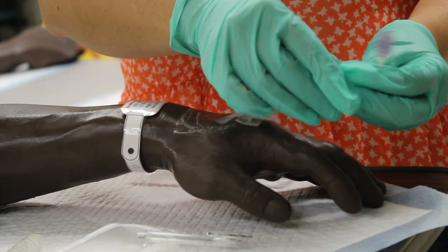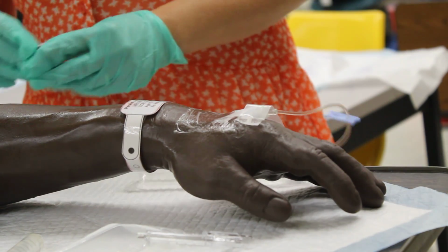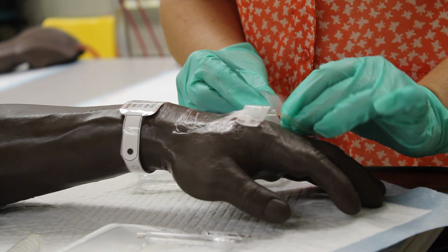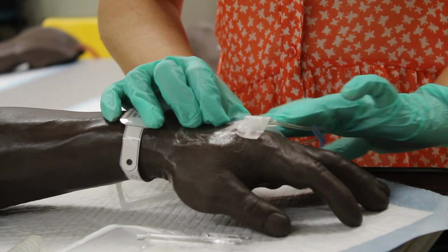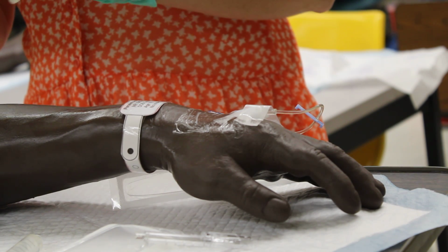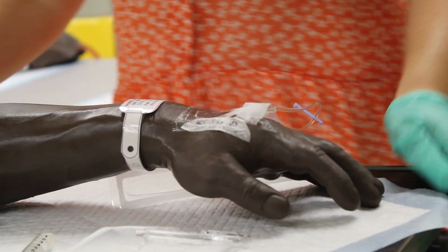You can go ahead and clamp your extension tubing so that you can create a positive pressure. And then you want to stabilize, take down your extension tubing so that it is not moving around. Then I can get my label that I filled out earlier and apply that to my patient as well. I've got my IV started.